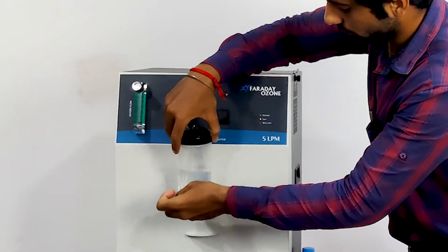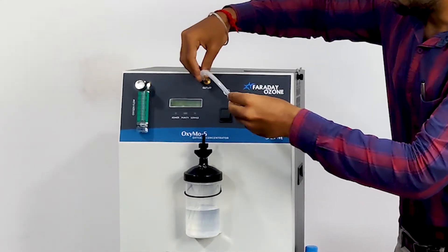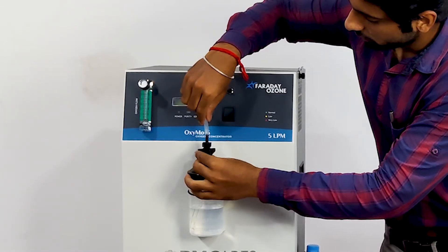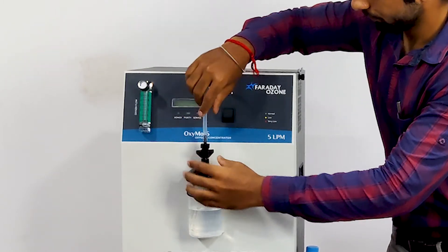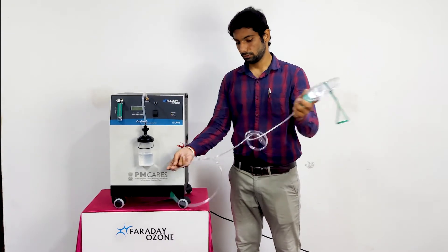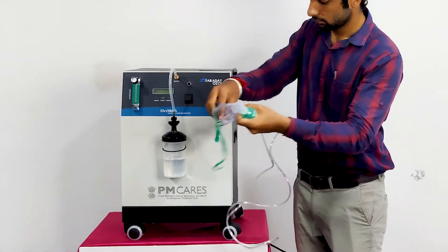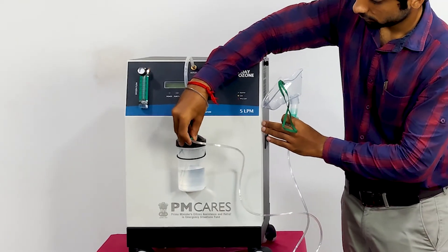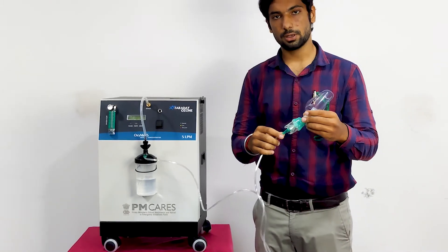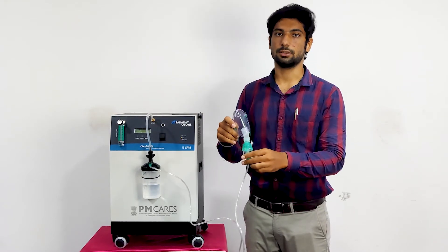Close the Humidifier Bottle. Using this connector, connect the Oxygen Outlet and the Humidifier Bottle. Here we have the Nasal Cannula — connect it to the Humidifier Bottle. This Nasal Cannula comes with a Nebulization Kit. Now the machine is ready to run.